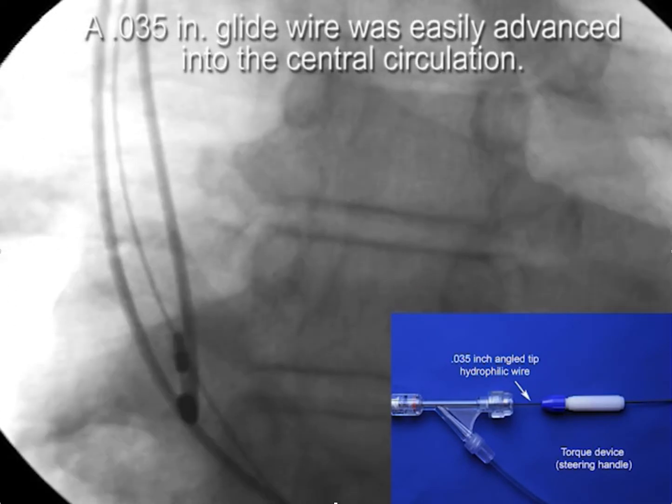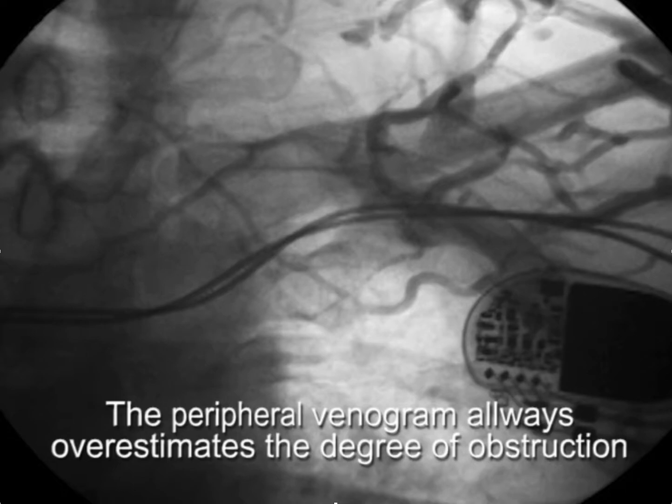Once the wire is through the occlusion, a sheath can usually be advanced, exchanged for an Amplatz wire, and venoplasty performed if necessary. In some cases, you can even do this without venoplasty. It's important to understand that the peripheral venogram always overestimates the severity of stenosis.